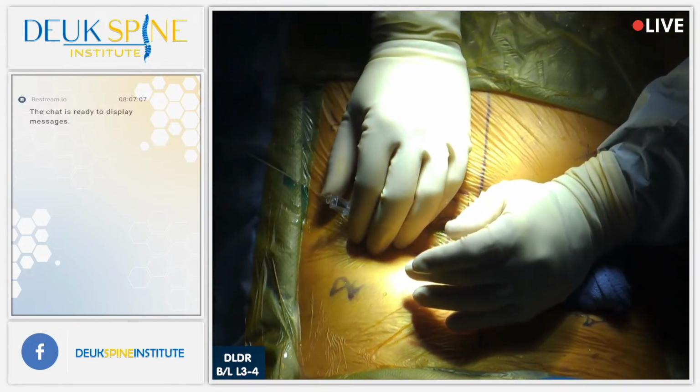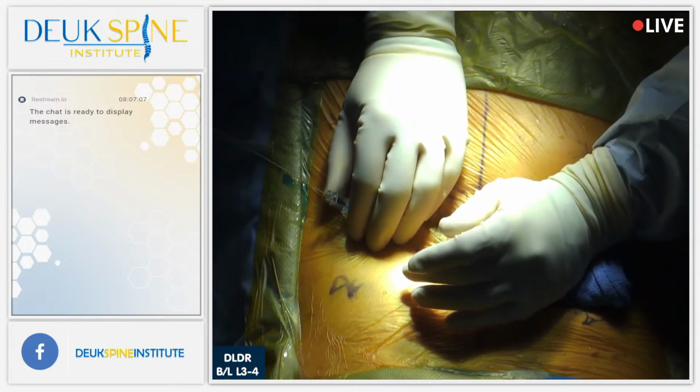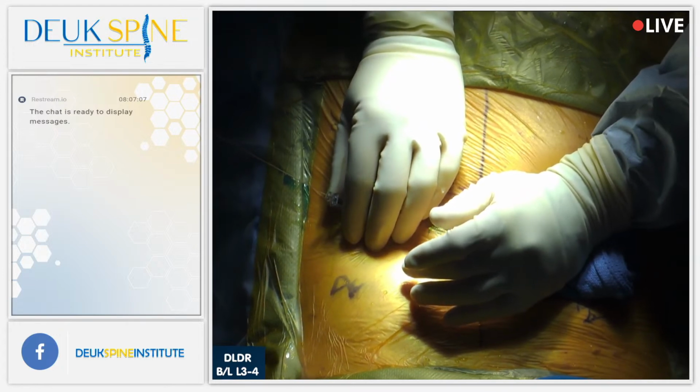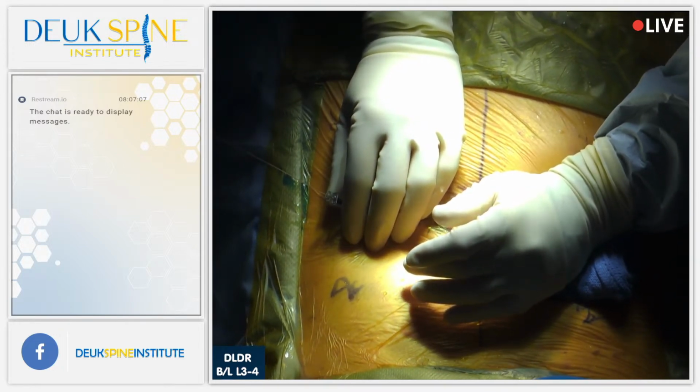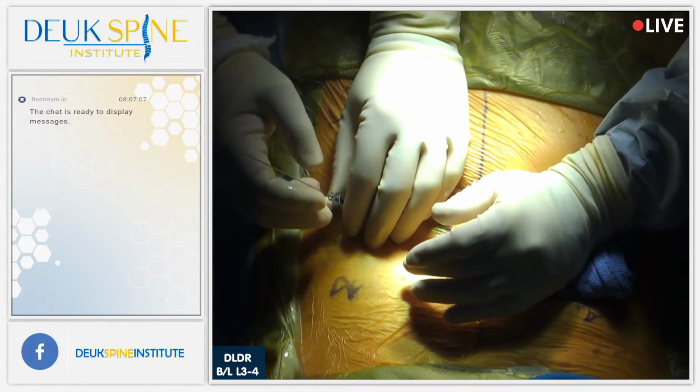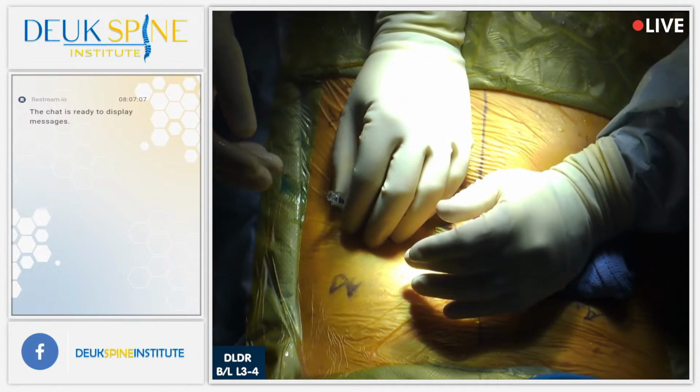Did you raise the fluoro? No, sir. We needed the bed up a small amount, quarter inch. That's good. All right, so we're here on the right side at L3-4. Shot. I placed the guide wire. There, shot.